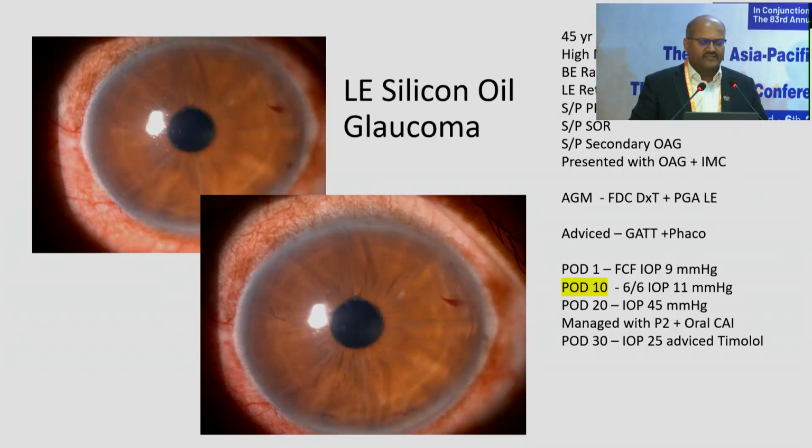So this taught us that we shouldn't use too much steroid after doing many of these procedures, because we opened up the channels, the outflow pathway is almost opened up. So if you use a lot of steroids, they do get a steroid response. How they get it, we don't know, because we have ripped open the channel, and that's again debatable.